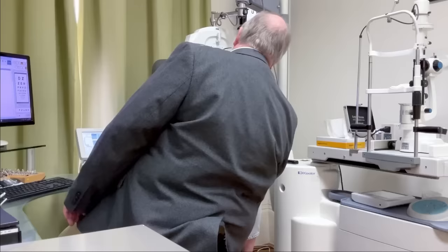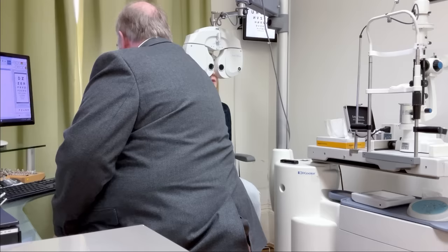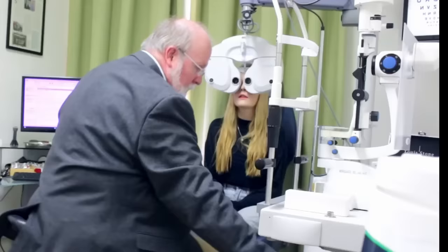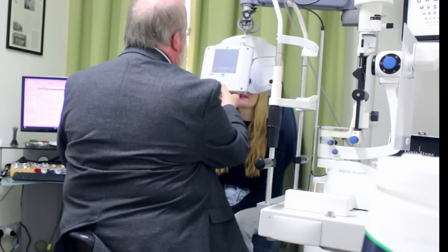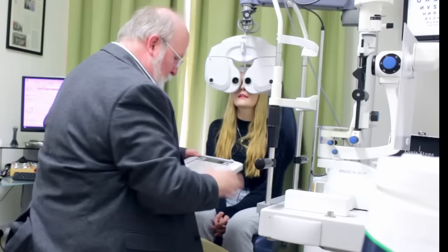Good to hear. So let's just have a look at your near vision, just make sure that's doing what it should be. So I'm just going to get in the way. And can you see the N5 there again? Oh, yeah. Is that quite easy to see? Yeah. And can you still see it here? Yeah, it's easier to see. And can you still see it there? Yep. And still see it there? Yep. You'll do nicely. Well done.